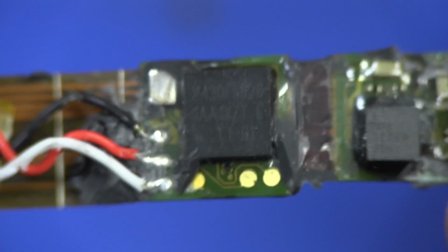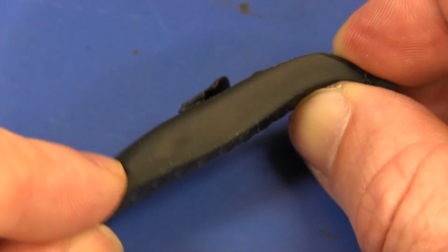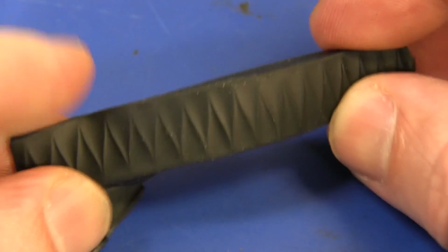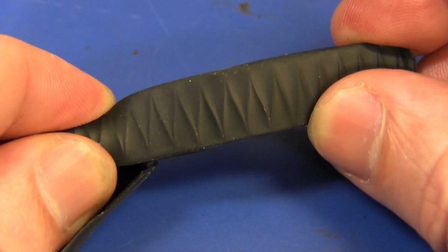There's some fancy algorithms in there to read and filter out the data from that accelerometer and figure out what's going on. But yeah, all the smarts is in there. Hardware-wise, if you looked at the schematic for this thing, it'd be, whatever. And by the way, this outer rubber here is supposed to be hypoallergenic TPU rubber, whatever that means. I guess for those people out there who have some sort of aversion to rubber products.